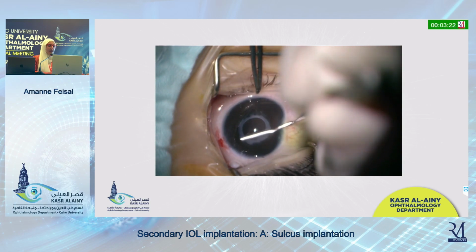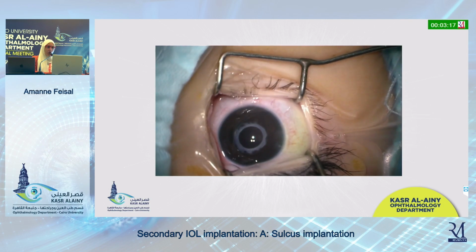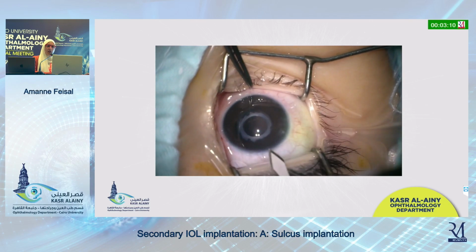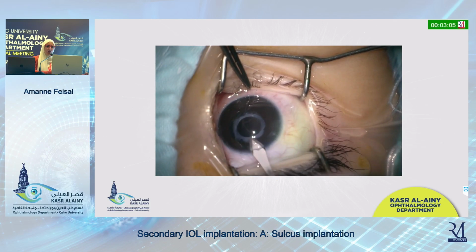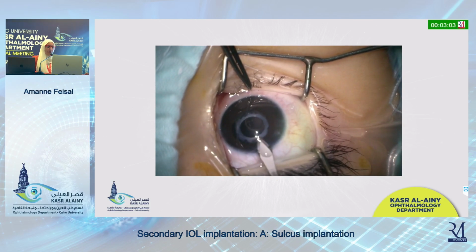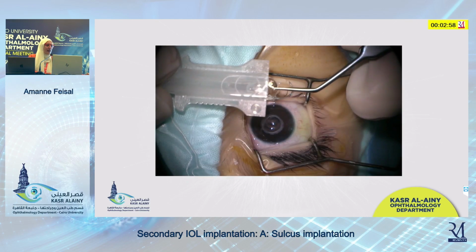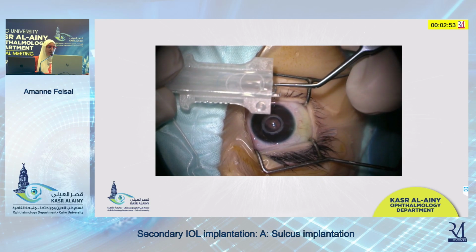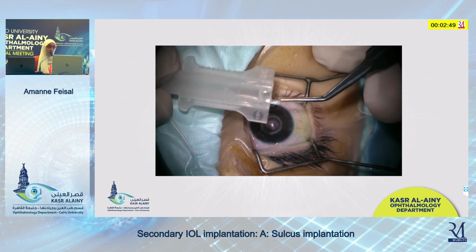And then she will open her main incision. She finds the globe a little bit soft, reforms, and then opens the incision with the keratome. She will widen the incision a little bit as the keratome is smaller than 3 millimeters, and you will need to widen it so you can introduce the plunger, the cartridge. Here, loading the IOL, it's very important that you load the IOL by yourself and following all the recommendations of the manufacturer.